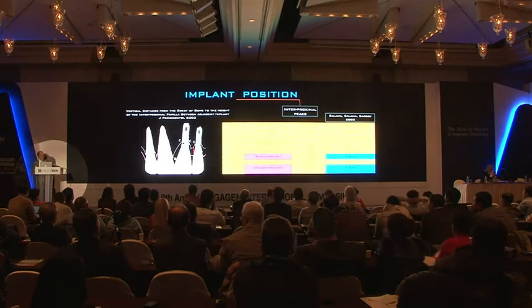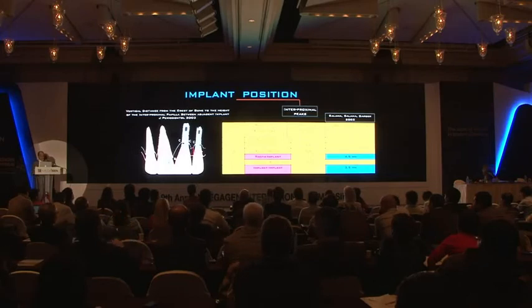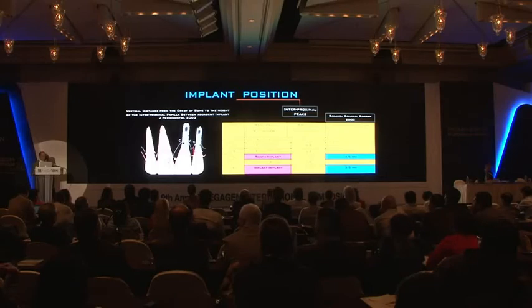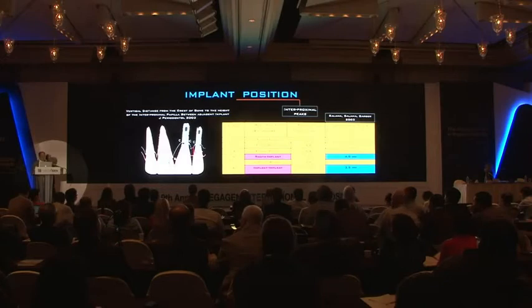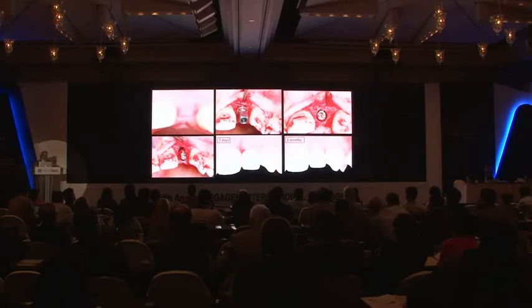So, what will change at the clinical level if we use a conical connection? First of all, we can insert the implants closer than 1.5 millimeters, as the literature advises us, because by not having the resorption of the crestal bone, we do not have a vertical soft tissue limitation. It's the case of this young woman. The orthodontist did not leave much space to insert the implant, but even if we insert our implant so close to the teeth, we still have a nice aesthetic result.